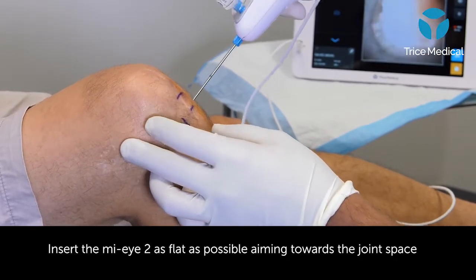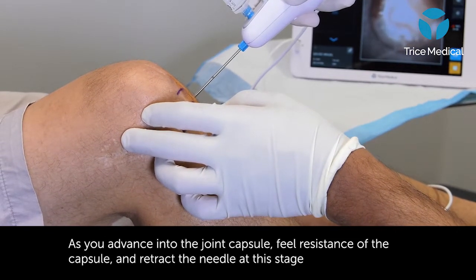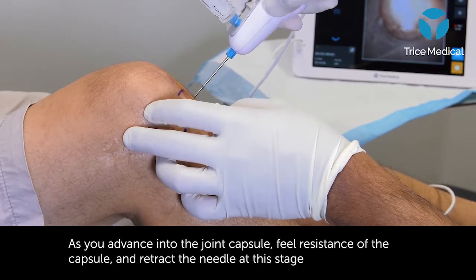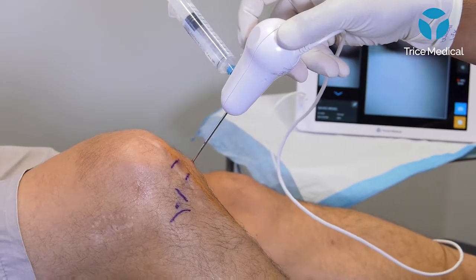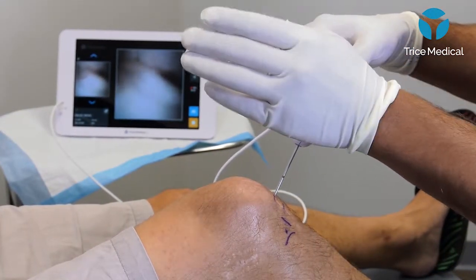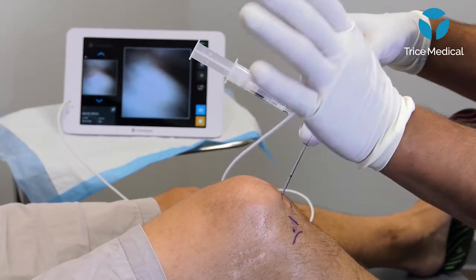Here's a really good example of getting yourself in trouble. I'm only at 30 in — if I retract my needle I think I'm in, but I'm not deep enough. You see me push in — so there, I'm in the joint; there is the compartment. If I drop my hand at this point and try to show them the ACL, I'm going to get into the ligament of mucosa and I'll be lost. Do not ever do that.